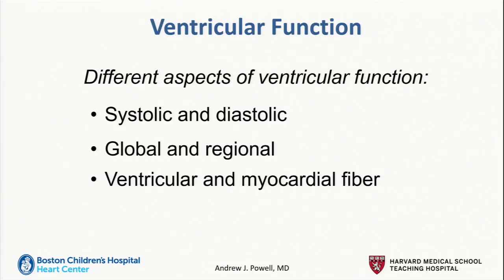So when you think about ventricular systolic function, there's different kinds of dimensions you can contemplate it over. First, the systolic and diastolic function. And as I said, we'll do diastolic function after the break. There's also, when you think about the function, you can think about it global, how well is the pump working, versus regional, how is this area of the myocardium doing compared to another area of the myocardium.